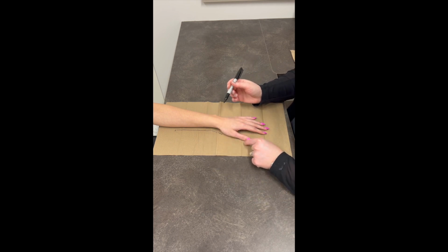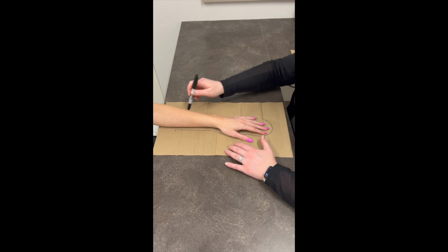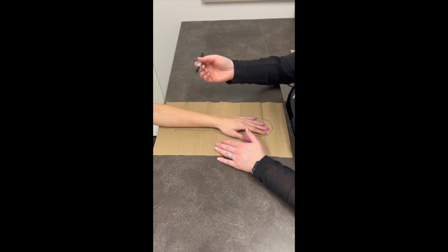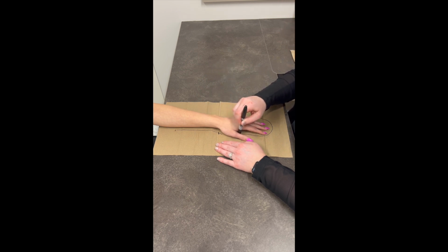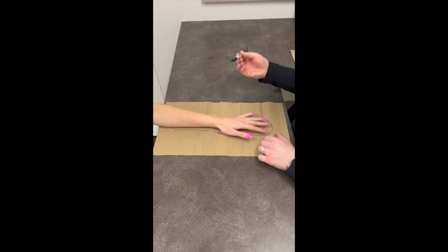Right now, I'm not going to include the thumb on this outline because we will be making a cutout for the thumb. Okay, and now I'm going to mark some landmarks. So first I'm going to mark the smallest portion of the wrist, the first web space, and also the second web space.